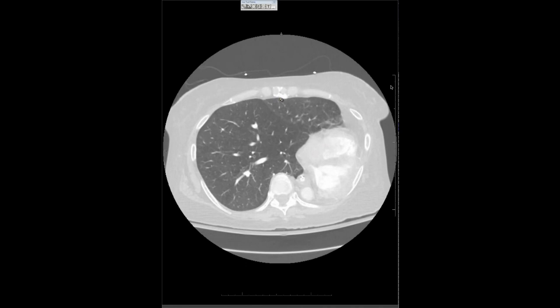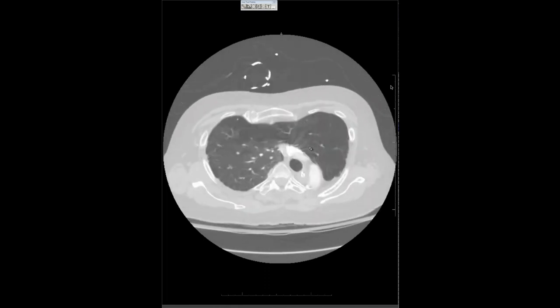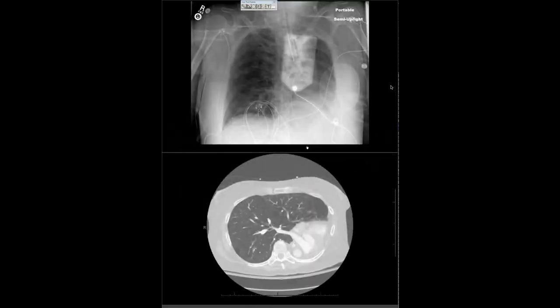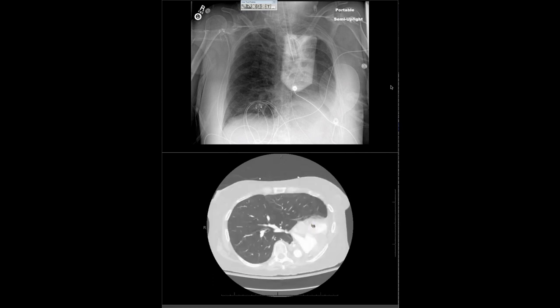It's interesting. So, I thought the anterior junction line was usually tethered to the sternum there. No, it can move around like this. And this is mediastinal rotation. So the mediastinum is rotated, and it rotates more profoundly in this direction to the left than it does to the right, but it can go both ways. And it's as if the hinge for the mediastinal rotation is the descending aorta, which doesn't move very much. This one has slid a little bit posterior, but it stays pretty close to the spine. So if you view that as the hinge, the rest of the mediastinum can rotate. And so the rotation is greater anteriorly where you're far away from that hinge point.